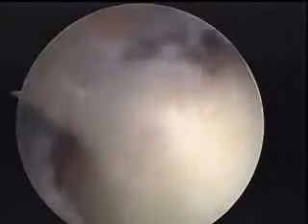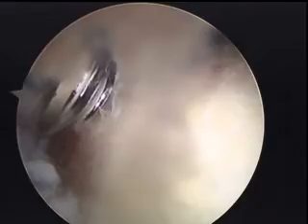The other complication with this is what's called heterotopic ossification of bone. You can see from all these small pieces of bone that are being burred out, I'm sucking them up at the same time, but these can get trapped in the muscle around the hip, and also just from the portals that we make, it damages the muscle. The muscle can get confused. Instead of healing into normal muscular tissue, it can actually form some bone, and this can cause some stiffness of the hip. So occasionally we will watch for this and put people on medication to prevent this extra bone formation in the wrong area.